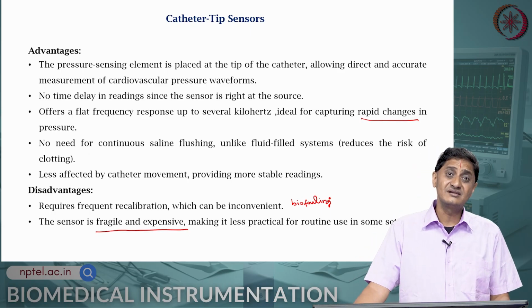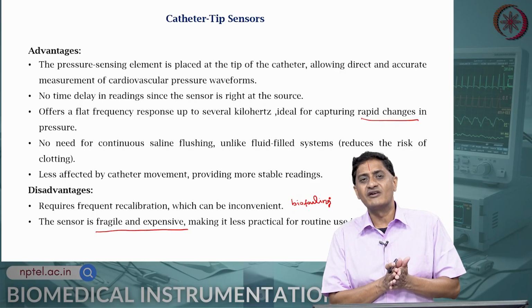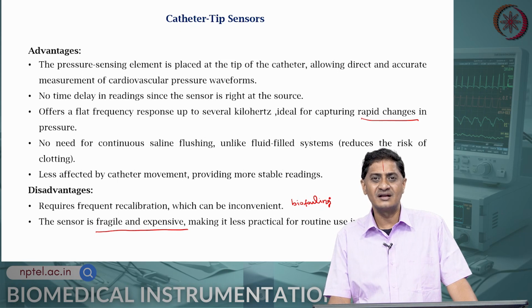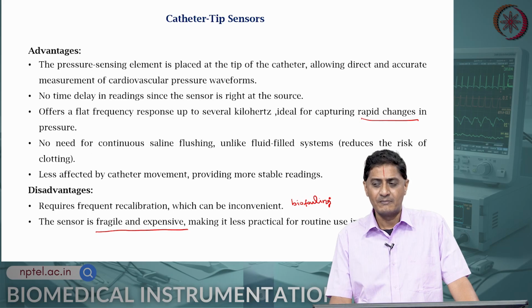Another factor can be that there can be shear forces that the sensor will have to withstand and tolerate without getting damaged. That is another factor that is often overlooked. There will be considerable amount of shear. So, the sensor is only measuring forces in a particular direction, but it may not be able to measure forces or pressure in directions that are parallel.